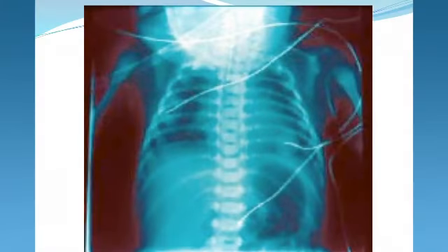This baby, on the other hand, was a preterm infant born to a mother who had ruptured membranes at 15 weeks. And you notice that the lungs are only inflated to about 7 ribs, but they are clear at that point. And so what you know is these are small lungs and you've cleared out the problem, but if you push them too much, you will injure them because they are small and fragile.